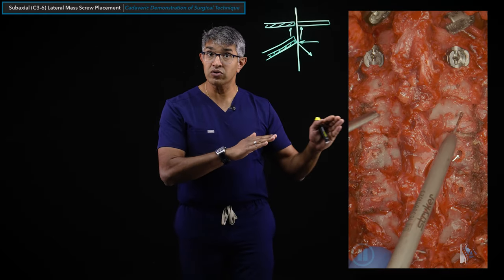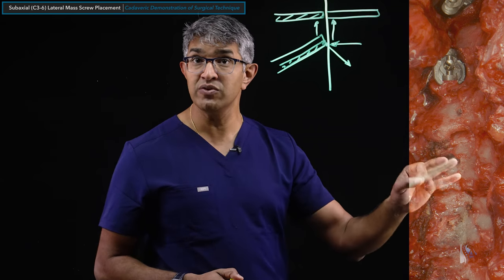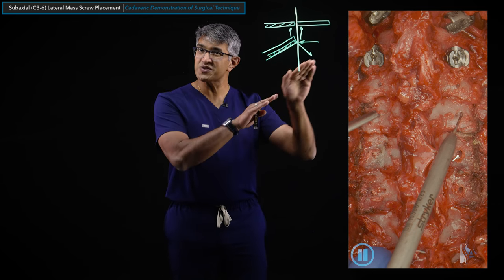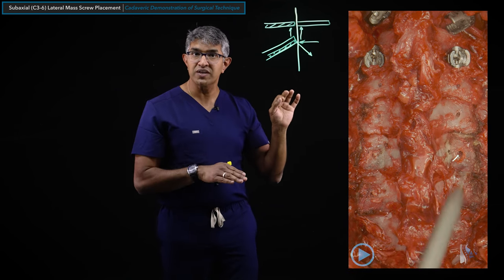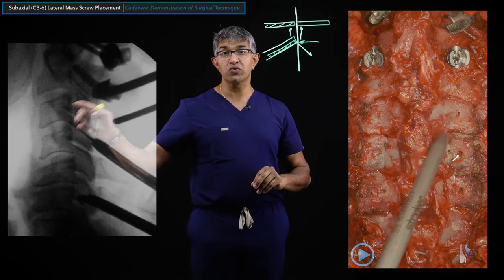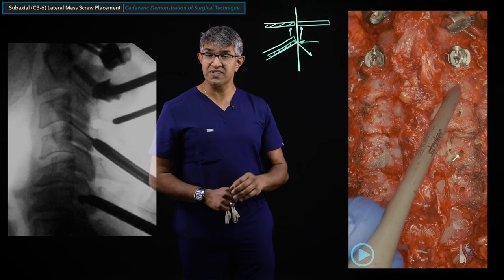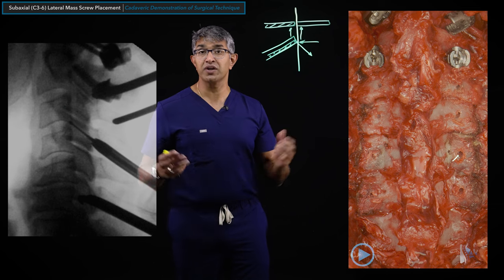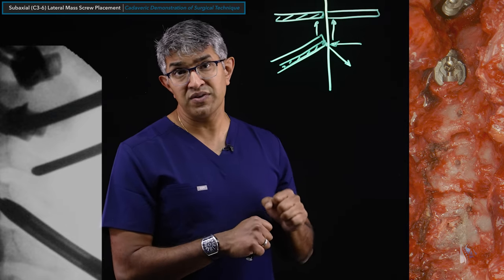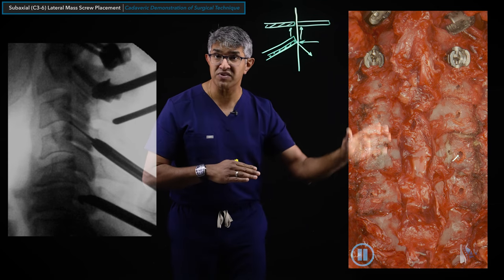Another option for pilot holes is a 1.7mm drill bit - which you may have seen in C1 or C2 lateral mass or PARS screw videos. Because it is a smaller bit, it doesn't skip quite as much. You make a start point and then comfortably direct it laterally and rostrally. I'll consistently use either technique throughout a case rather than mixing them. When teaching residents or fellows, the Stryker hand drill or power drill with a guide tends to work better for monitoring trajectory - it's a dealer's choice how to create the pilot holes.